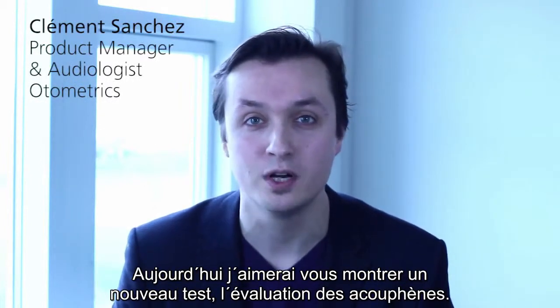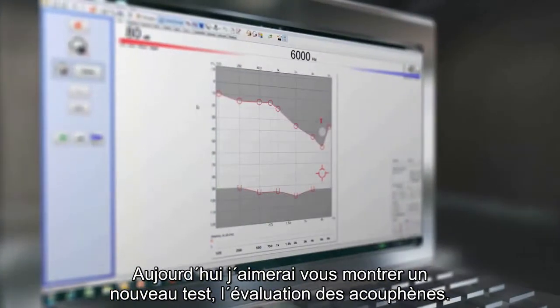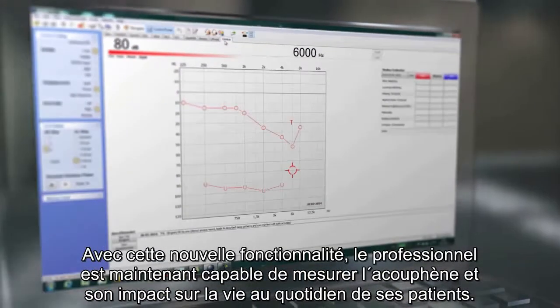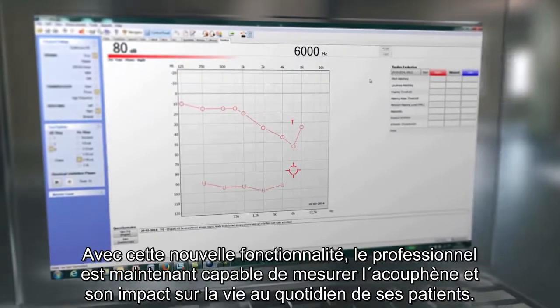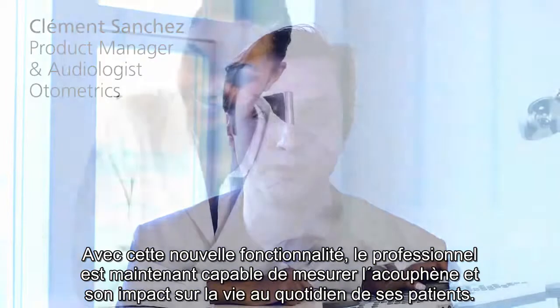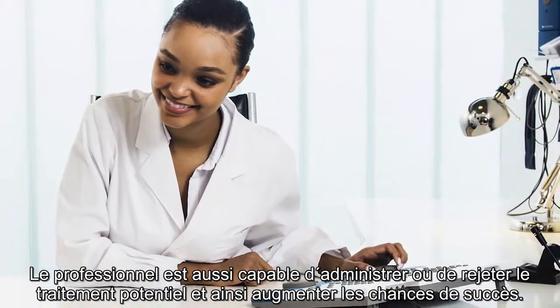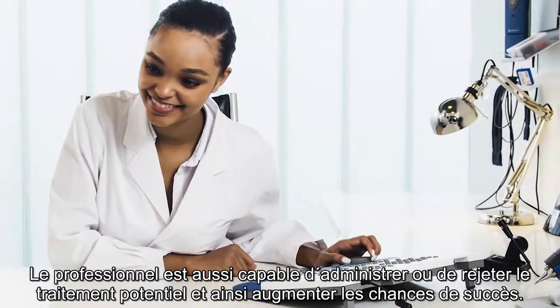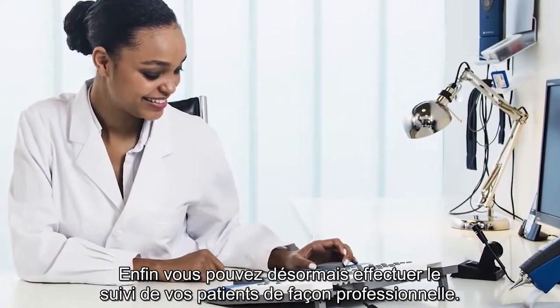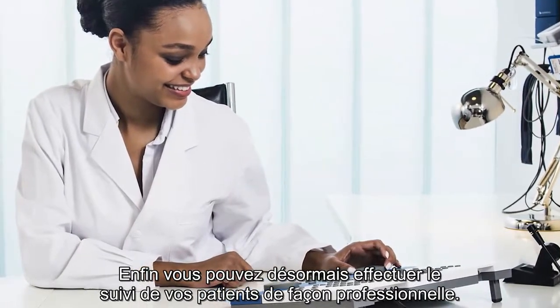Today I would like to show some exciting new test modalities — the tinnitus test. With this test modality, the professional is now able to evaluate the tinnitus and its impact on the patient's life. The professional is also able to select or reject the potential treatment and thereby increase the treatment strategy success. Finally, you can follow up with the patient in a very professional way.